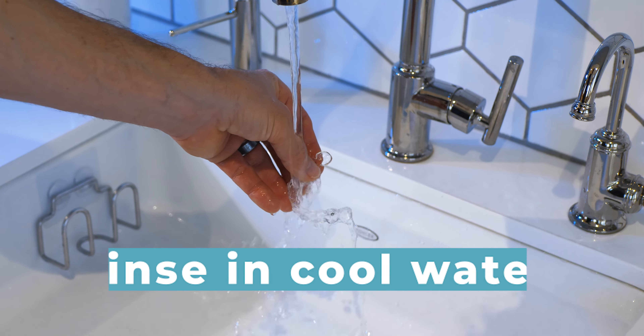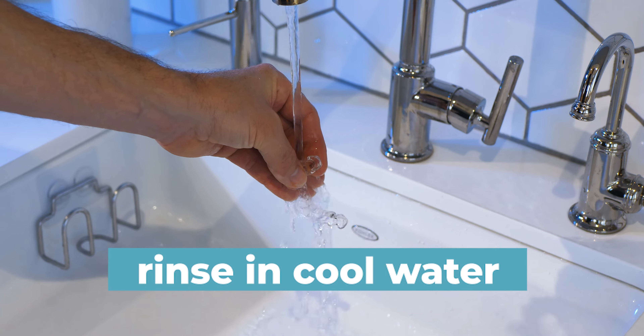Rinse aligners thoroughly with cool water before popping them into your mouth. If you have any questions, a member of our team is always here to help.